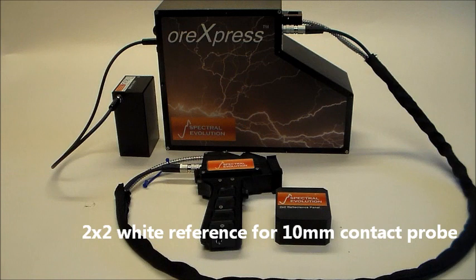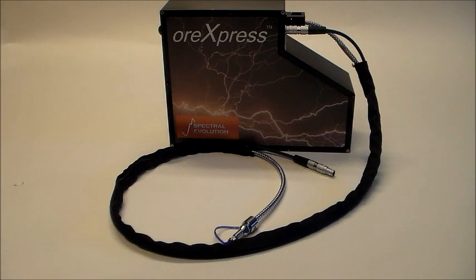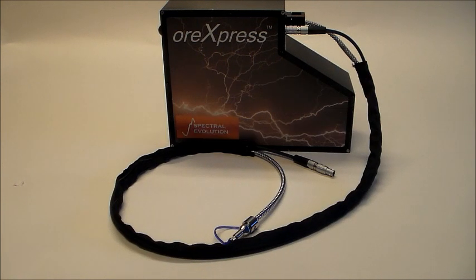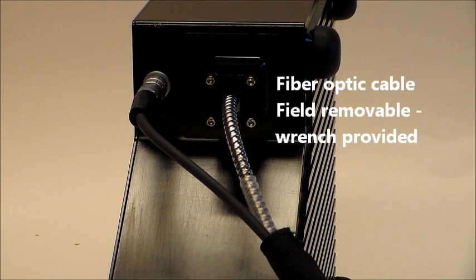The 10 mm contact probe includes a 2x2 white reference standard. The ORExpress uses three solid-state photodiode array detectors. The rugged design ensures field reliability with no moving optical parts to break down. The ORExpress has a power cable and fiber-optic cable that connect to the contact probe or benchtop probe.